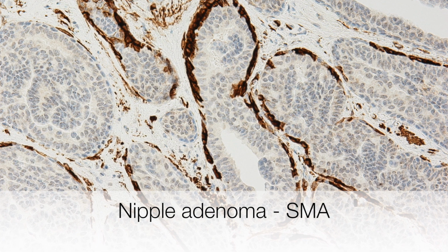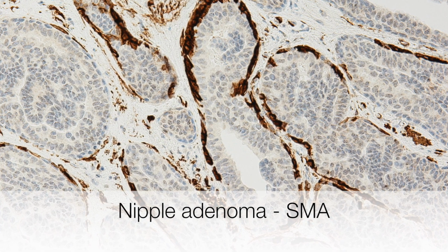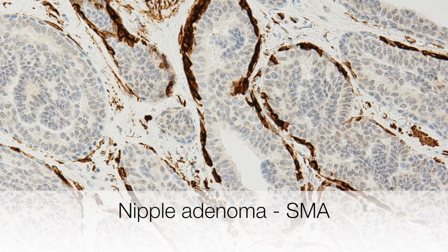And this is SMA or smooth muscle actin, again highlighting the myoepithelial cells.